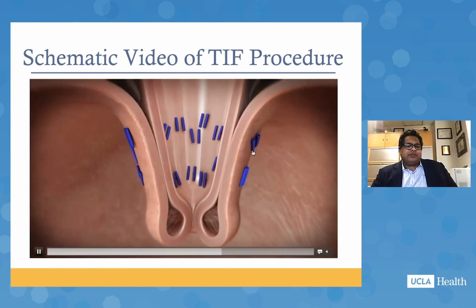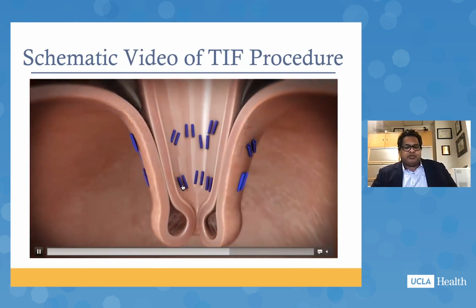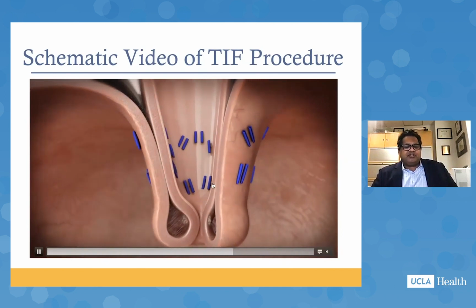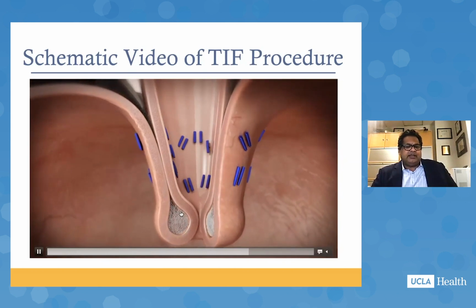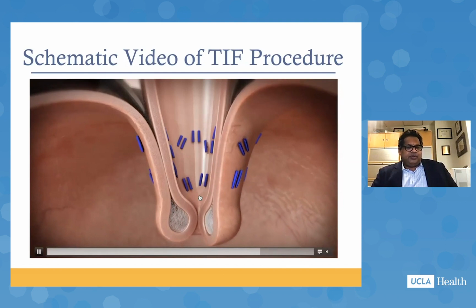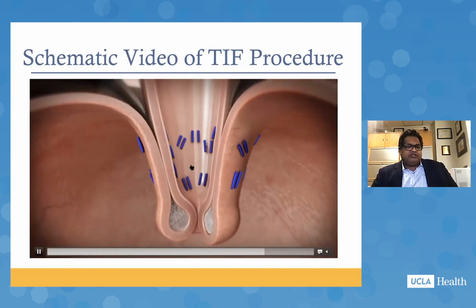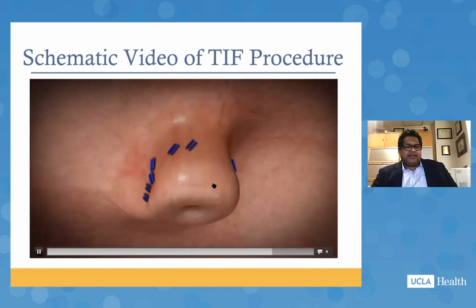When you finish, you end up with approximately 20, 23, potentially even more, depending on what you want to do. And you get this omega-shaped valve. So this is a bit like a toupee. And then the idea is that with serosa to serosa, you're going to get serosa fixation here, which will make this more durable, which is why in the early days, we don't want a lot of solid food. We don't want big chunky things here that will stretch or put tension on this. And we certainly don't want emesis. So antiemetics are very important.